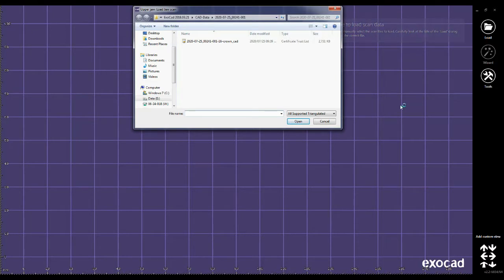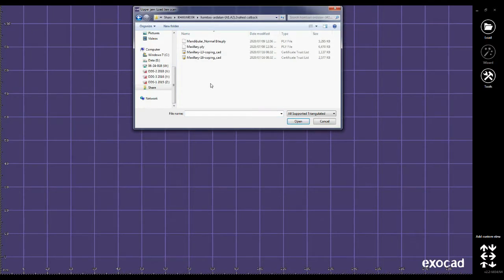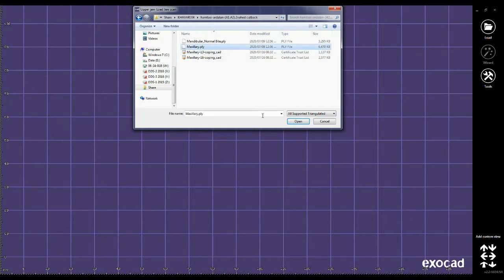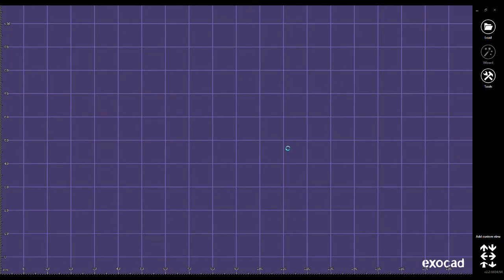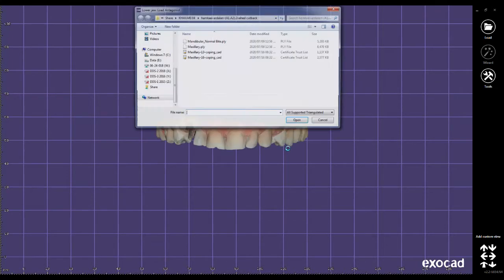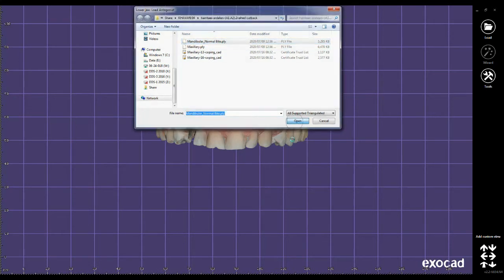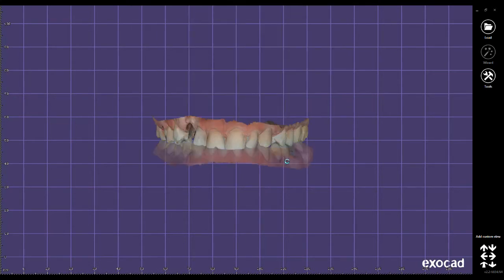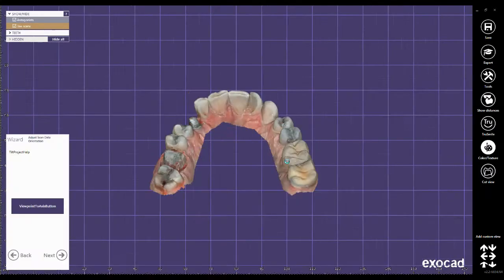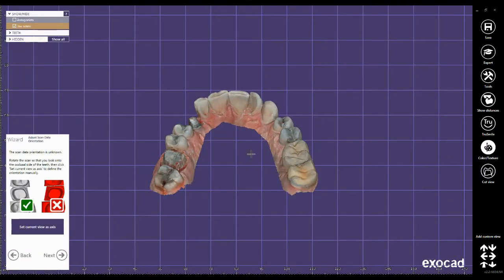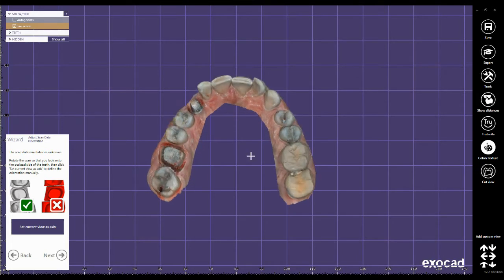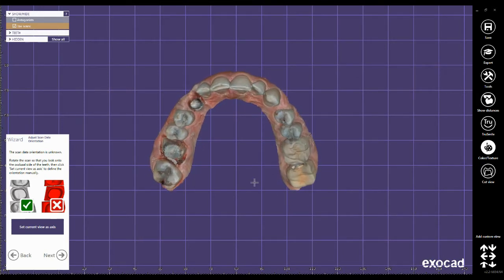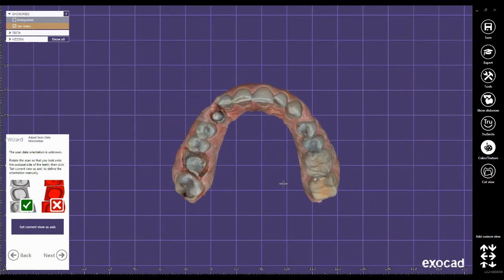Now I need to upload my upper jaw. Here I select the file and then click on OK, click Open. And now the lower jaw, that is my antagonist. Open, OK.